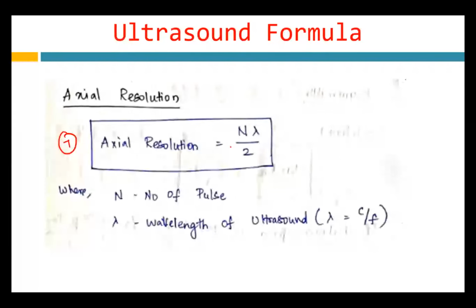So yes, axial resolution: in 2020 there was a problem on axial resolution, and in 2021 also. So it's nice to learn axial resolution. Axial resolution means you have passed some pulse wave, sound pulse, the number of pulses.